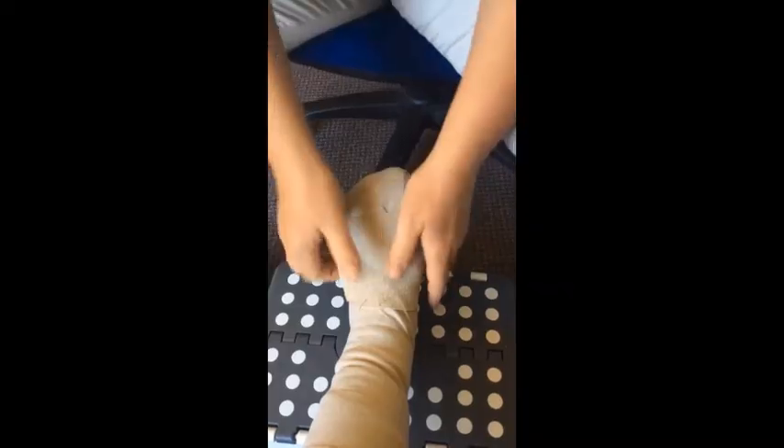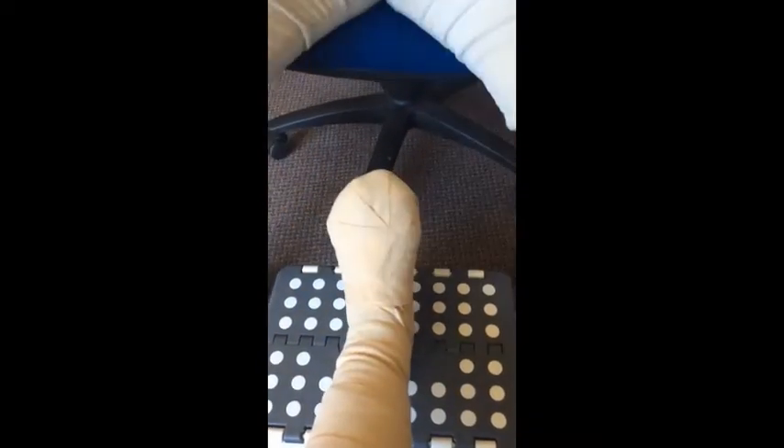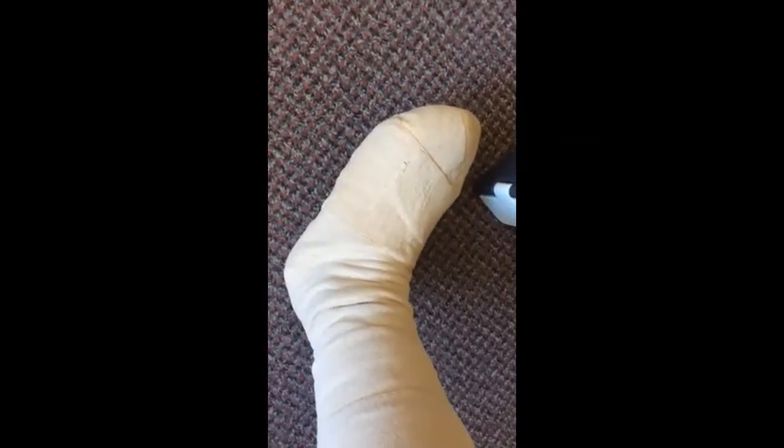And that's it — it's like a fan effect, and when you've got the hang of this and manage to get yourself a decent fan, it's one of those very satisfying moments. That's a piece of art there. As we say in Wales, give it a little 'cwtch' — a nice cuddle — make sure it's all nicely stuck down, and that's your stump bandaging. The patient should be able to wriggle their toes; they may say it feels a bit firm, but encourage them to wriggle their toes. Any movement they make will cause the muscles to contract, and bandaging around contracting muscles is what encourages the movement of blood and lymph fluid — so exercising your toes is a really good thing to do.